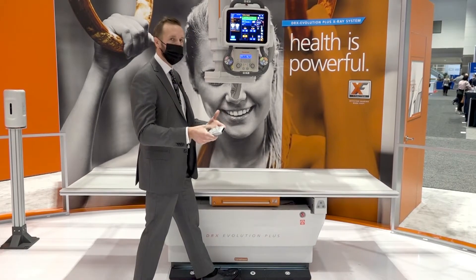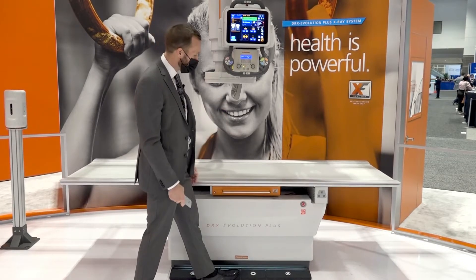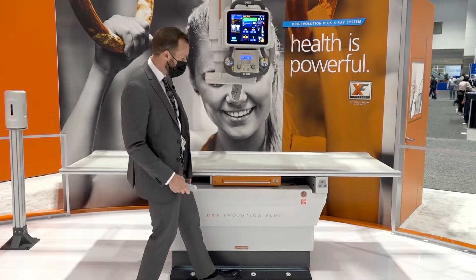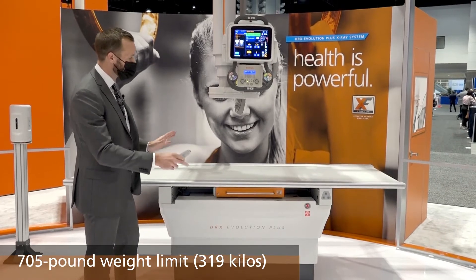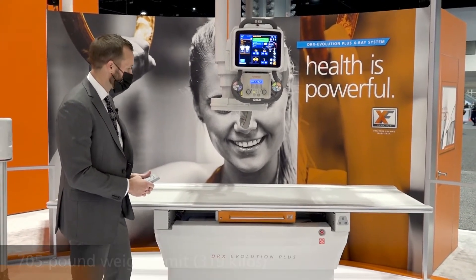If they want to be at a comfortable ergonomic working height, we're able to bring that up a little bit higher for them. The tabletop weight limit has also been revised, and it's been increased to 705 pounds, and that's with full float. So you're able to work even with larger patients with a full range of float movement for the tabletop.